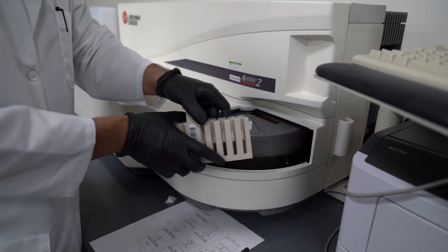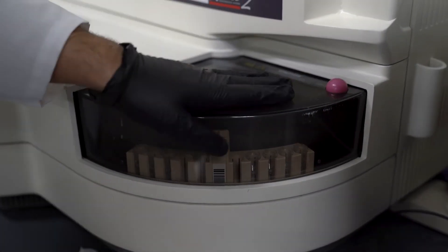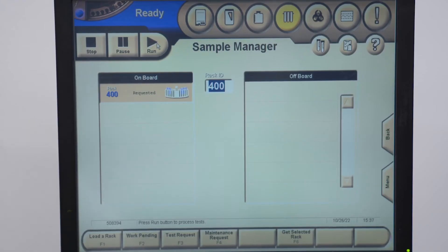Now we load the rack — take it, put it in here, close it, and click load the rack. When that's ready, hit run. You'll notice it moves from off-board to on-board, then just hit run and it'll start. After this, you can run your samples.